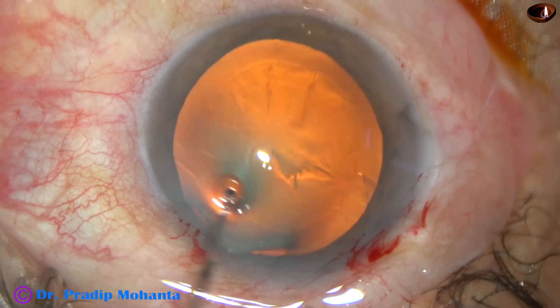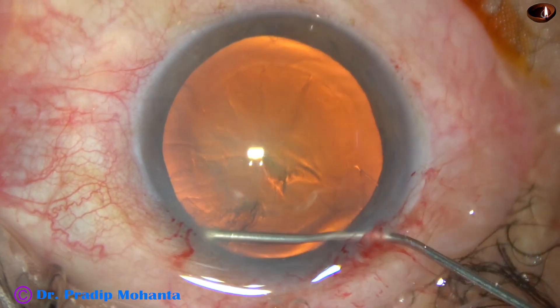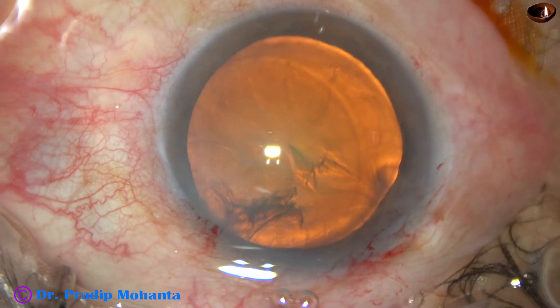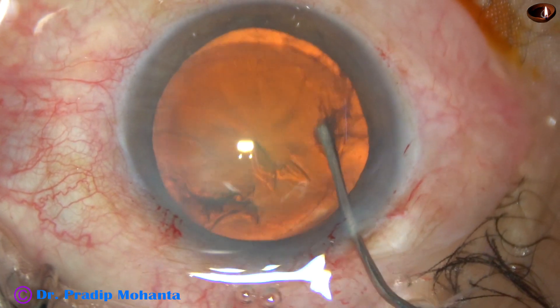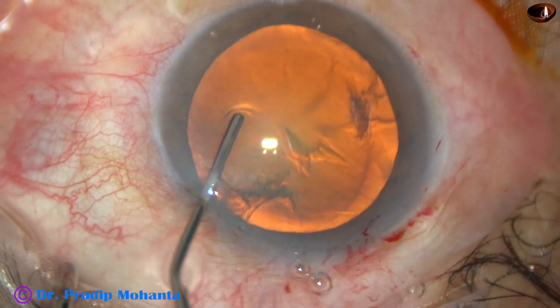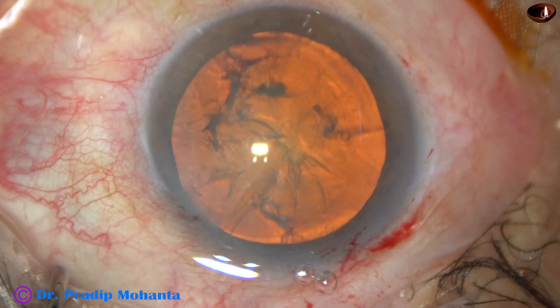And now, hydrodissection. A fluid wave is passed; the fluid wave goes to the opposite equator. The nucleus is tapped and the nucleus is rotated.